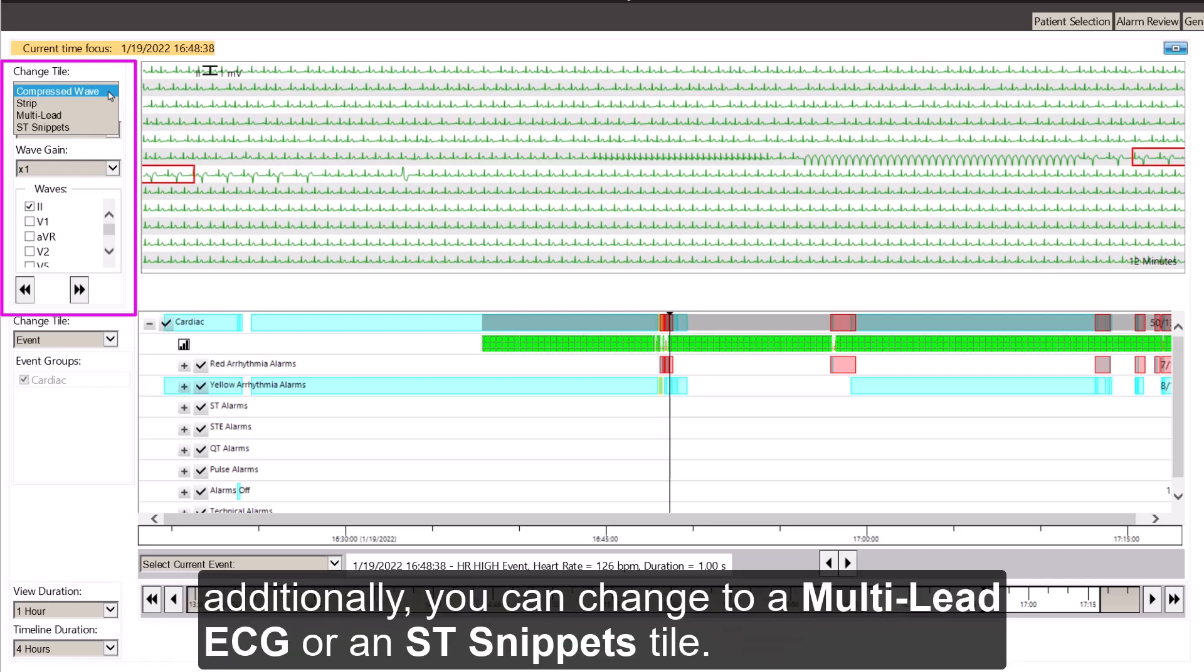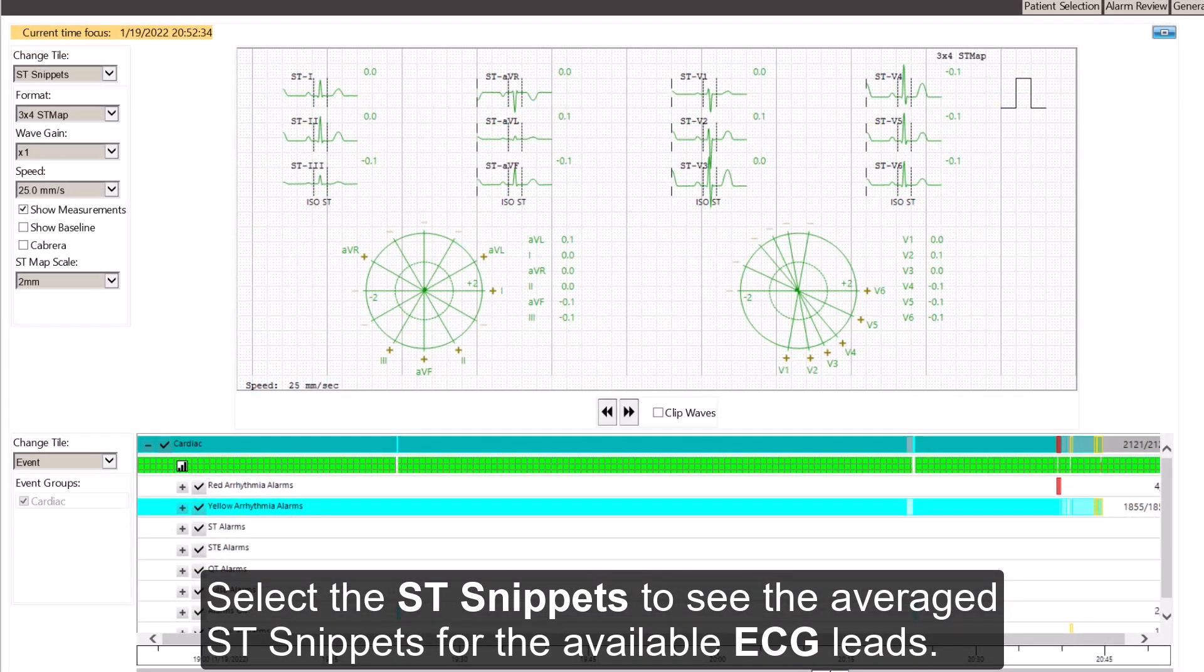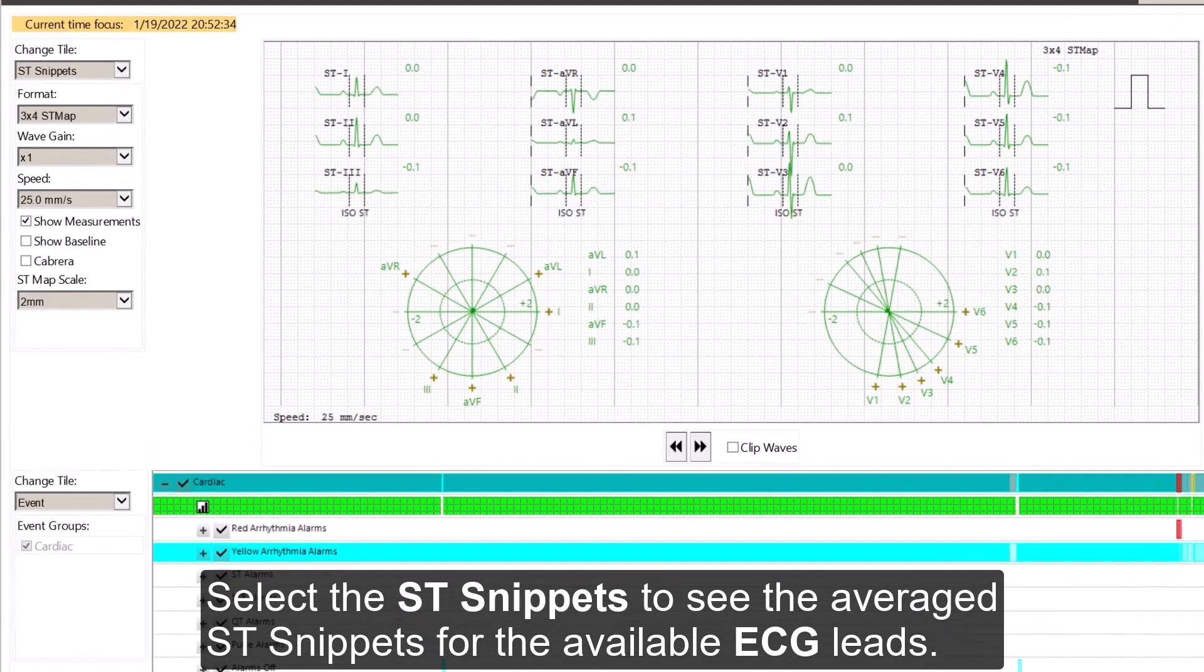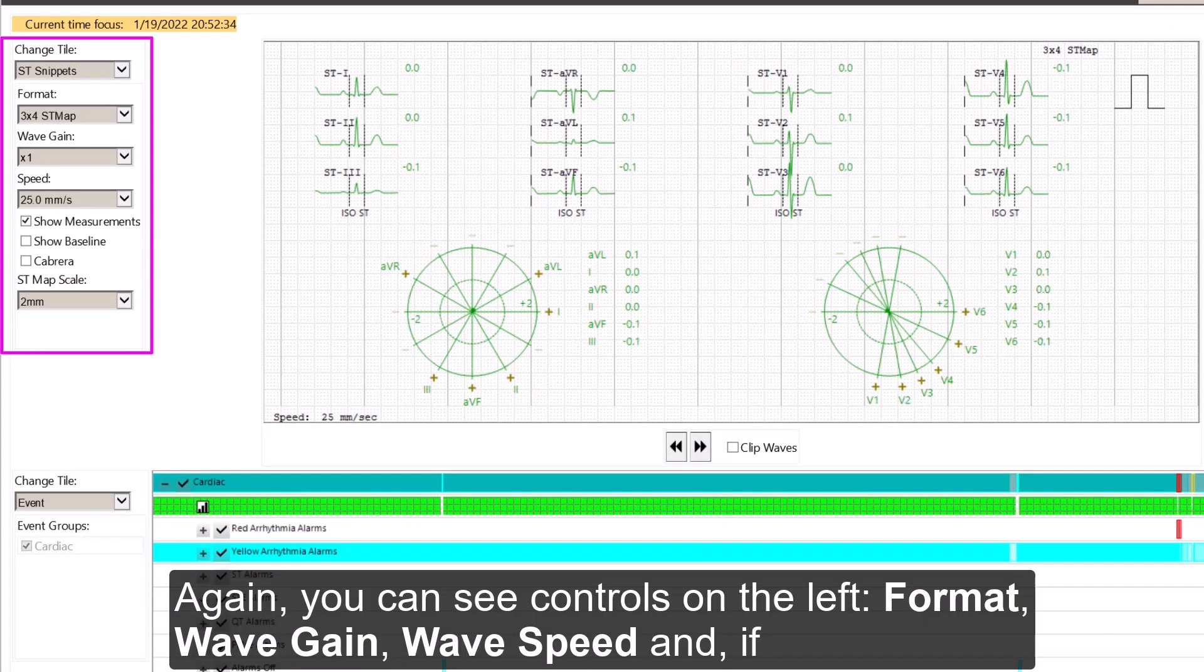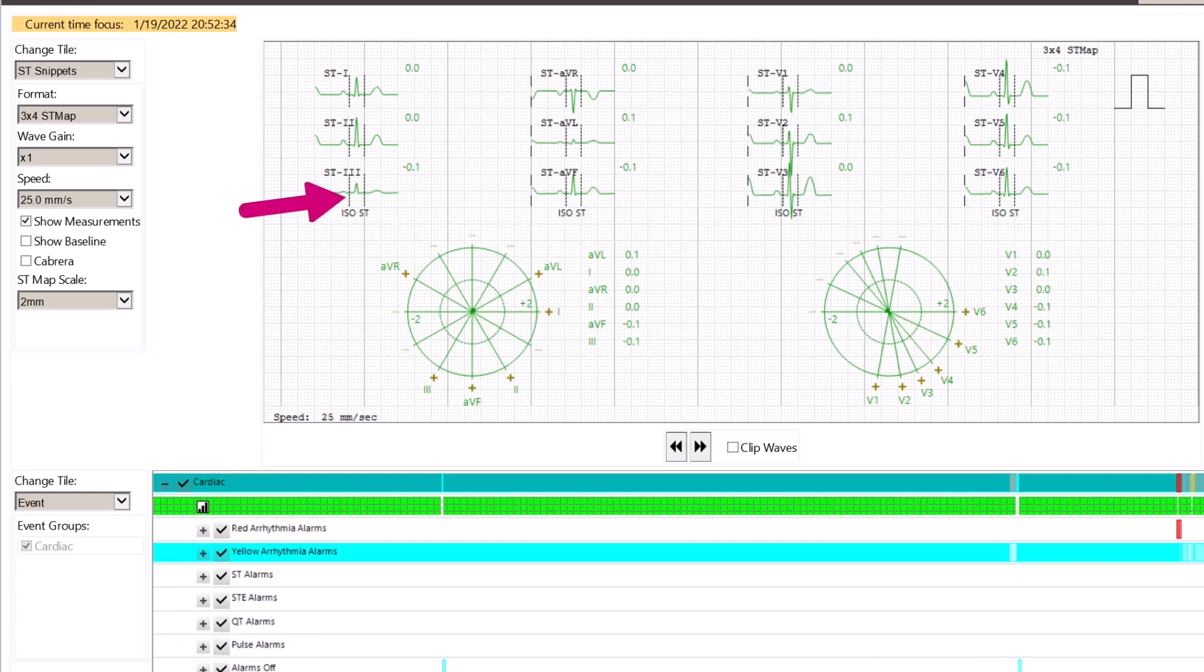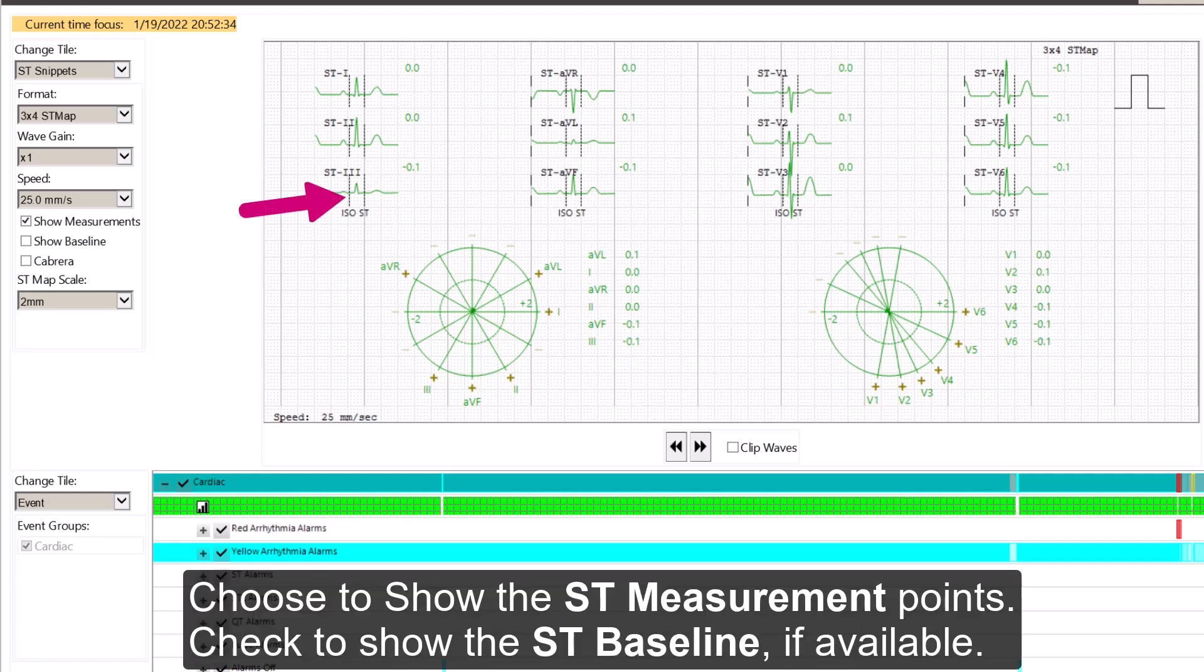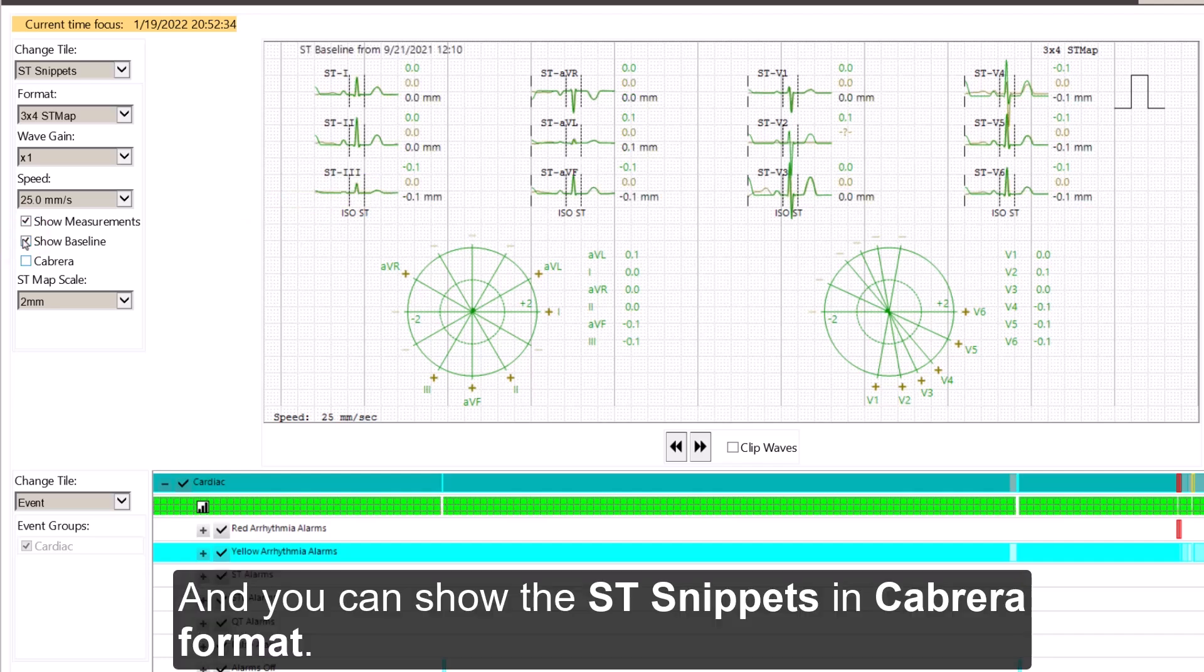But additionally, you can change to a Multi Lead ECG or an ST Snippets tile. Select the ST Snippets to see the averaged ST snippets for the available ECG leads. Again, you can see controls on the left: Format, Wave Gain, Wave Speed, and if available, the ST Map Scale. Choose to show the ST measurement points. Check to show the ST baseline if available. And you can show the ST snippets in Cabrera format.